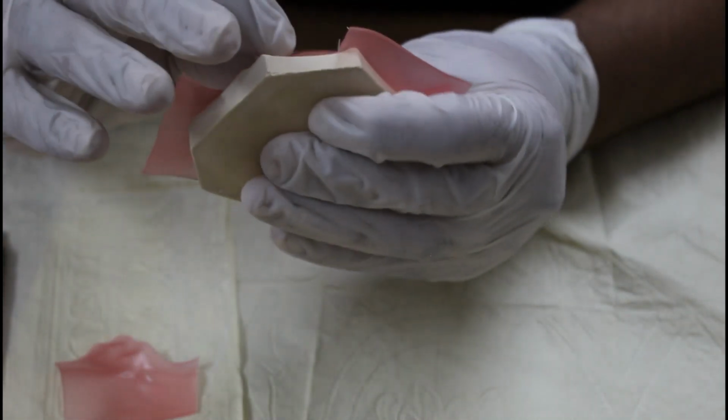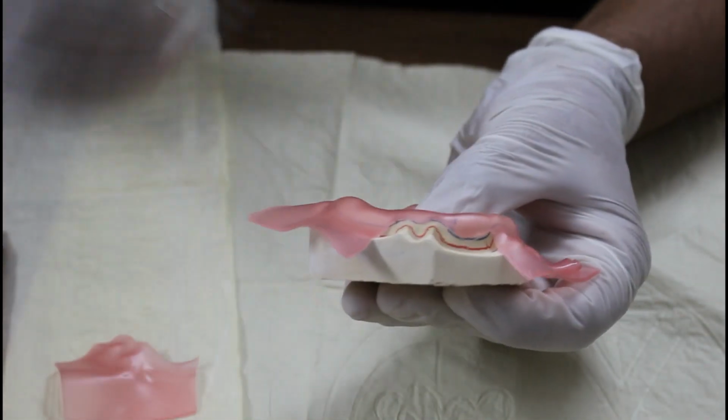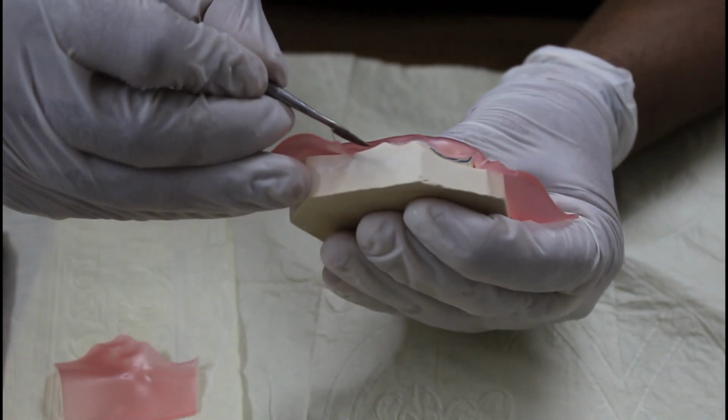Can you see that now? Till your blue color, you cut the wax according to the blue color lining.